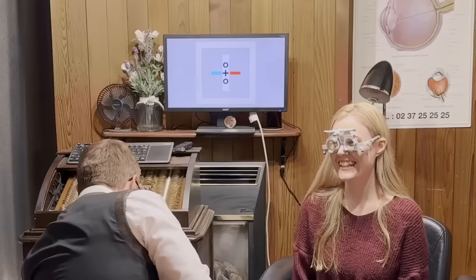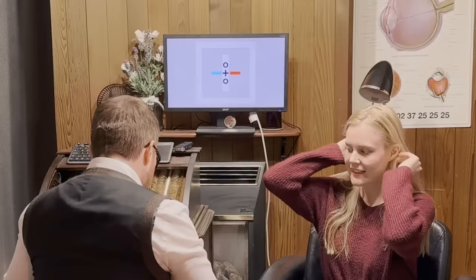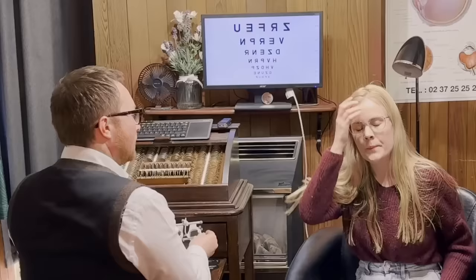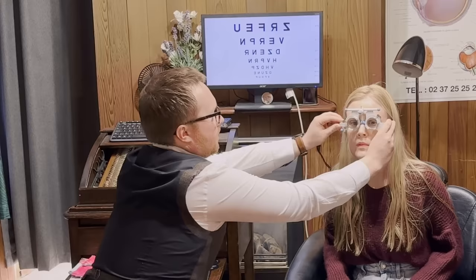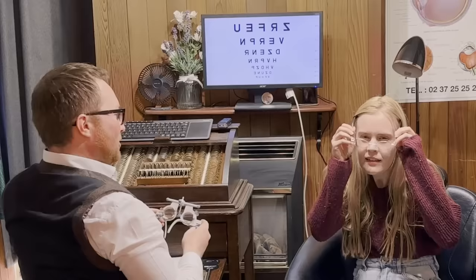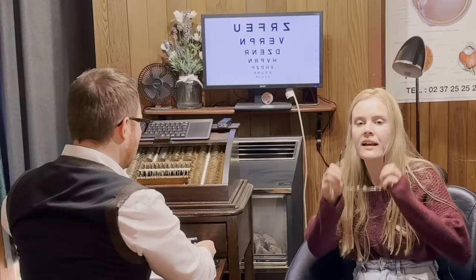Now, there's been a very marginal change in your prescription. If you wanted to pop your glasses on, I can show you the difference. I'll get the letter chart back up. So having a look at the letters there, obviously that's what you're getting at the moment with your glasses. And if you want to pop those off, and I'll hold these on the front, that's the difference. So not a huge change in prescription. Yeah. Maybe more a subtle change in clarity as opposed to you suddenly reading miles further down the letter chart. You're still getting a very good level of vision with those glasses.